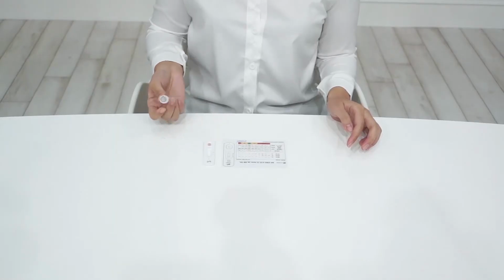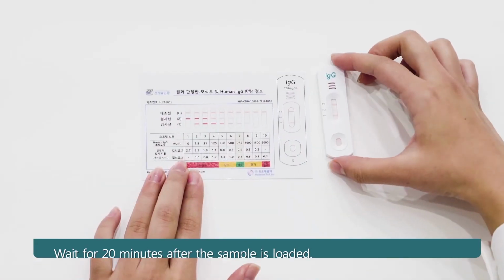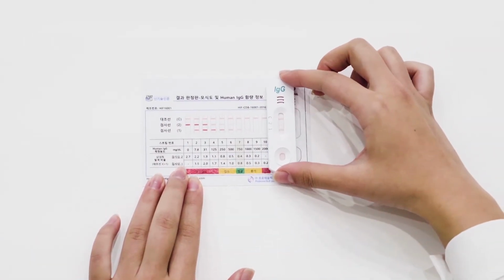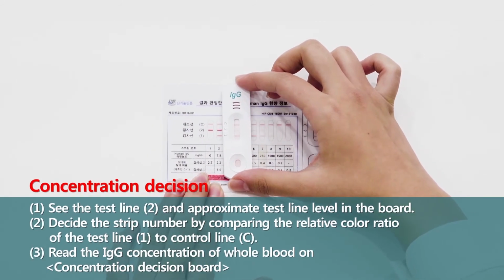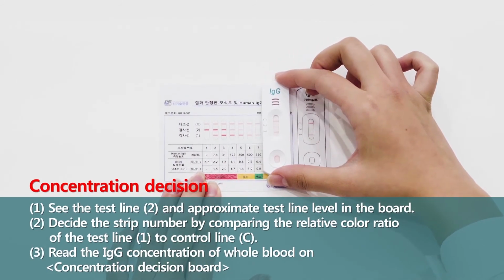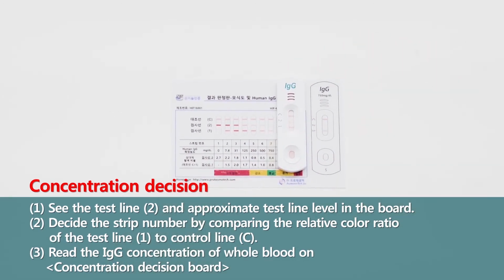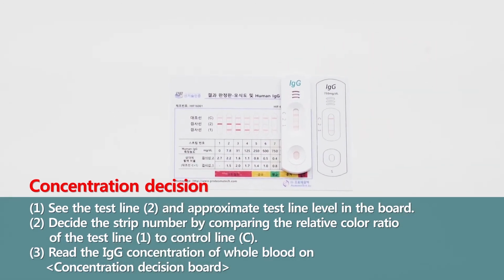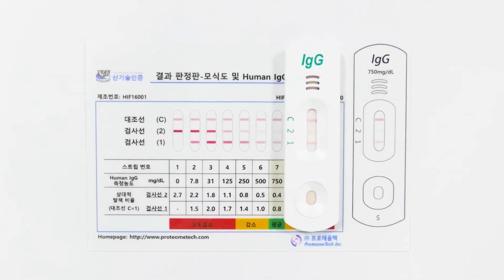Wait for 20 minutes after the sample is loaded. After 20 minutes, lines will appear in the middle part of the cassette. Compare this result to the chart provided and find a pattern in the chart that is identical to your result. Corresponding immunoglobulin G antibody level can be found right below the pattern in the chart. This way, you can check your immune level with ImmuneCheck IgG.